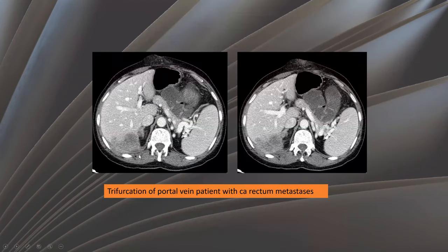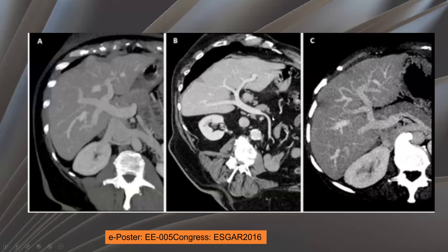Here, a patient with carcinoma of the rectum and metastasis to the subhepatic region of the liver, with a trifurcation of the portal vein — this is the posterior branch, this is the anterior branch, and this is the left branch. Here are additional examples from the literature showing the trifurcation of the portal system, and the configuration where the posterior segment arises from the main portal vein and the right anterior segment arises from the left portal vein.